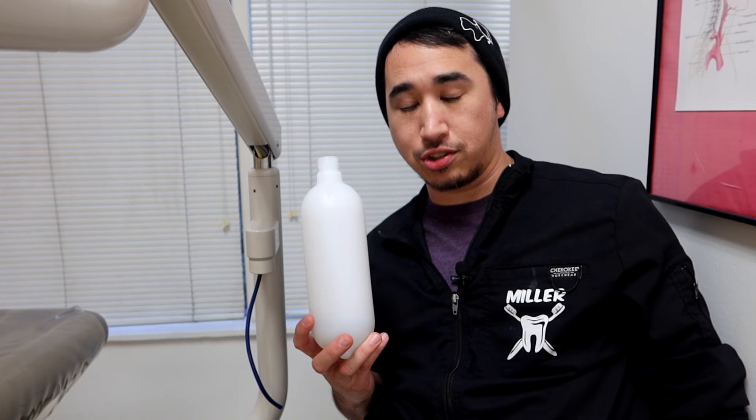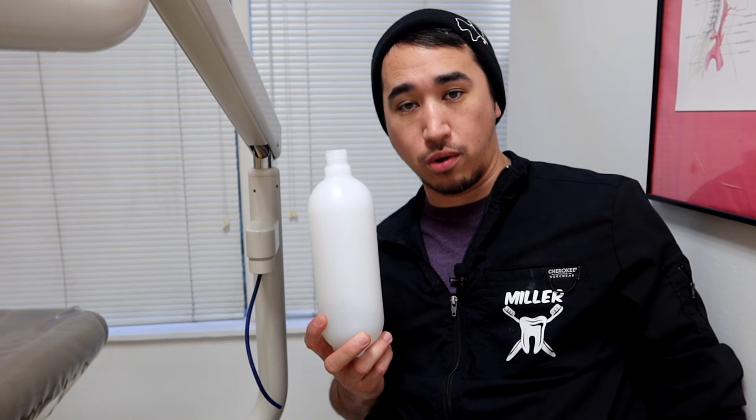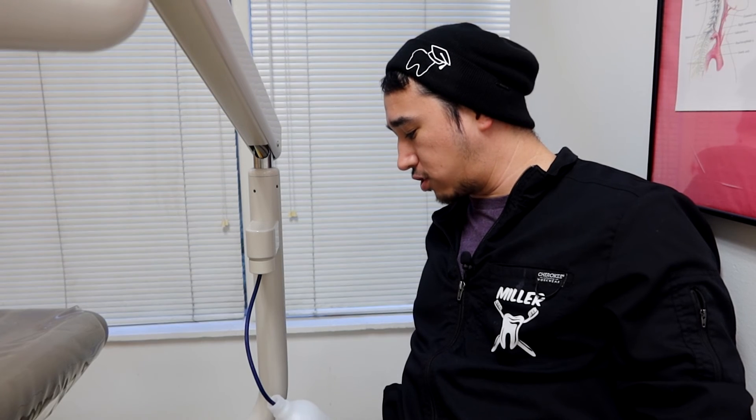With the master switch off, turn the bottle clockwise and pull it out from the straw — don't touch the straw. Get it filled with the appropriate water source. When reattaching, float the straw back in, seat the bottle all the way up, and twist it tight. Then power the unit back on. If you hear that hissing again, make sure it's fully tightened.